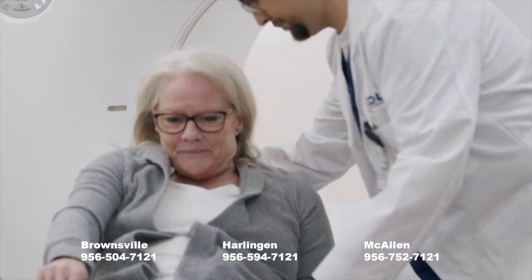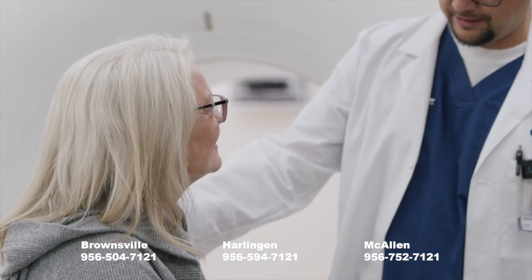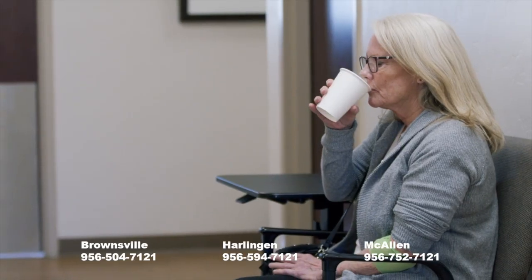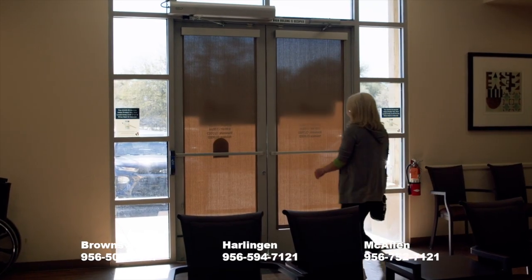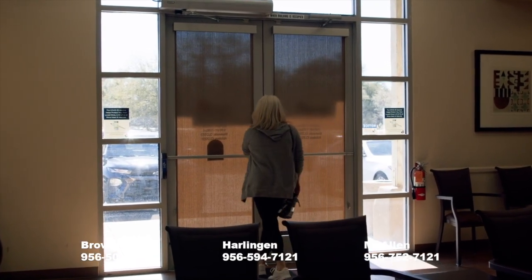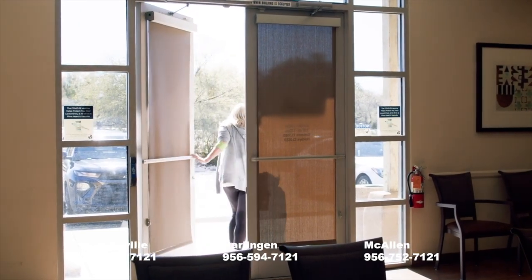In conclusion, the cardiac PET-CT procedure is a highly sensitive, specific, and accurate test that provides your physician with a wealth of information. This exam should take only around 45 minutes to an hour. You don't have to drink a contrast or dye. It is low radiation and could have minimal side effects.